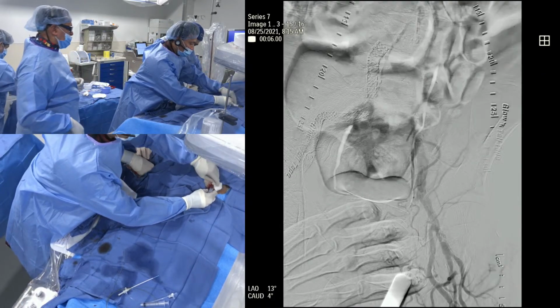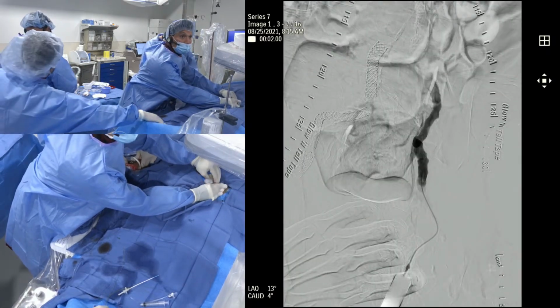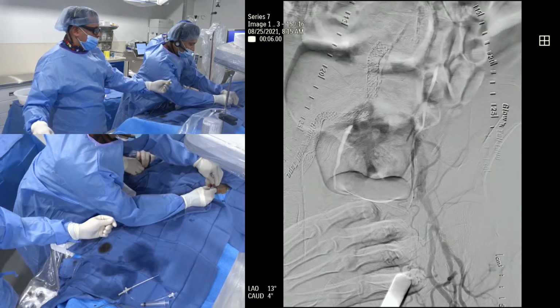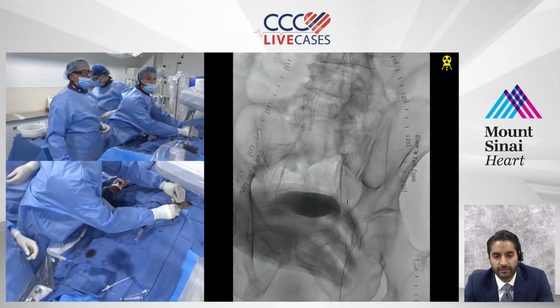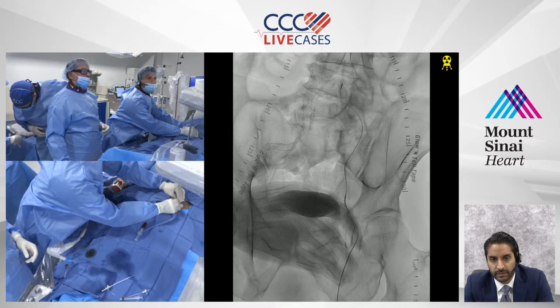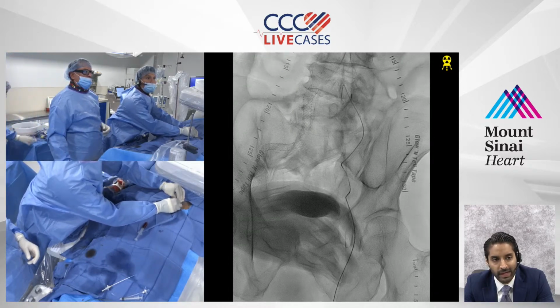So right now what we're going to do is get us a supercore wire. I don't think supercore will go. You won't go? Let's go with the woolly then. Yeah, let's put a woolly up. There you go. In these complex cases, Dr. Gershon, do you find yourself considering some form of non-invasive imaging, perhaps just a duplex ultrasonography, to help guide your case planning regarding access?